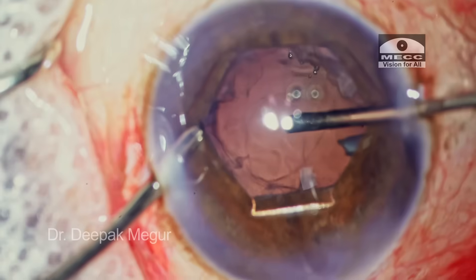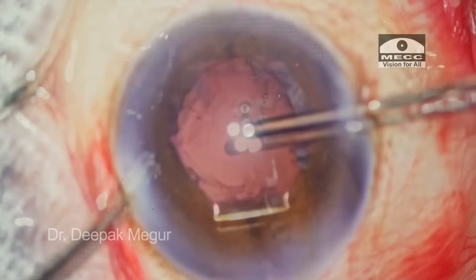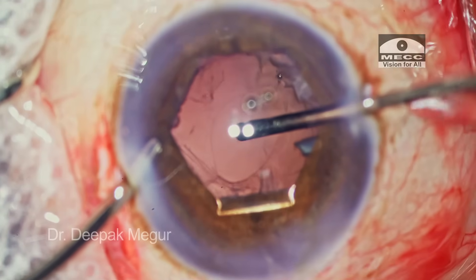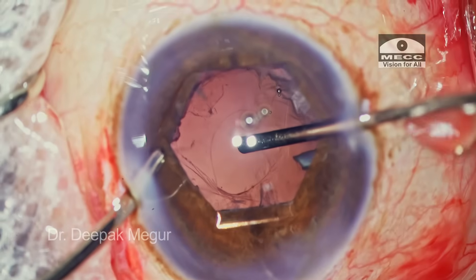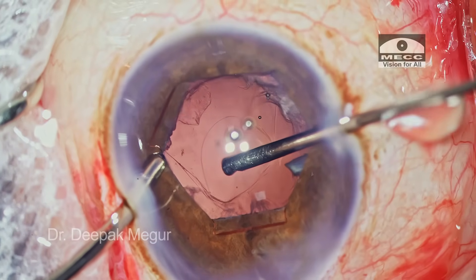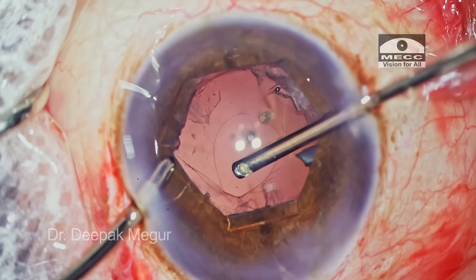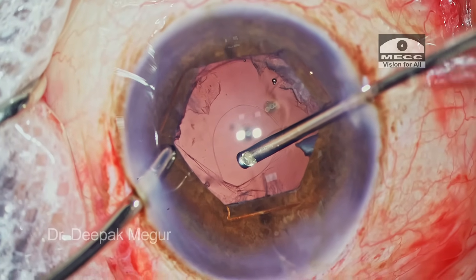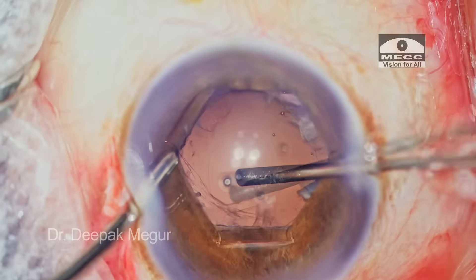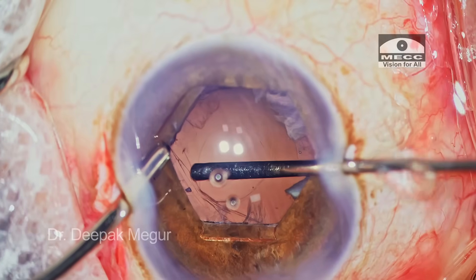There is a small lens particle that just went behind the posterior capsule — hopefully it will float up and we can emulsify it later. The cutter is held stationary and cutting is begun. Remember, you do not have to move the cutter a lot. Just be stationary; with the fluidics itself, the surrounding vitreous comes towards the probe and gets cut and aspirated. I am tilting the cutter to a sideways opening position to deal with the vitreous prolapsing towards the main wound. The cutter is held as still as possible — we do not want any aggressive movements inside the eye. We can still see that the margin of the tear is eccentric and kinked, suggesting a vitreous fibre running towards the main incision.